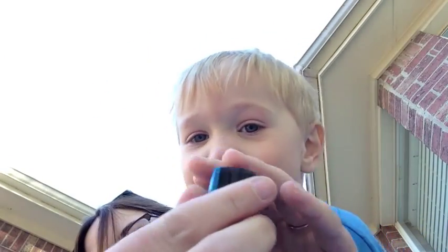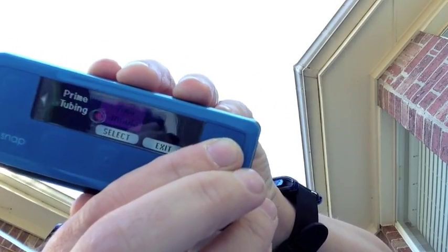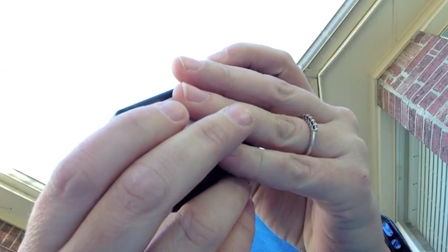So we're going to have a pump body connector. You can also customize the color of your highlighting on the new MySnap. I've chosen purple.